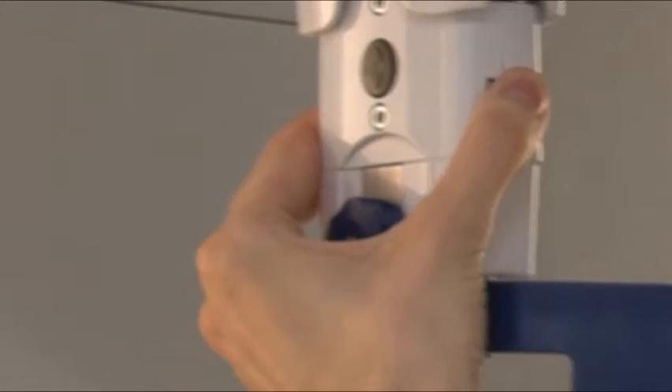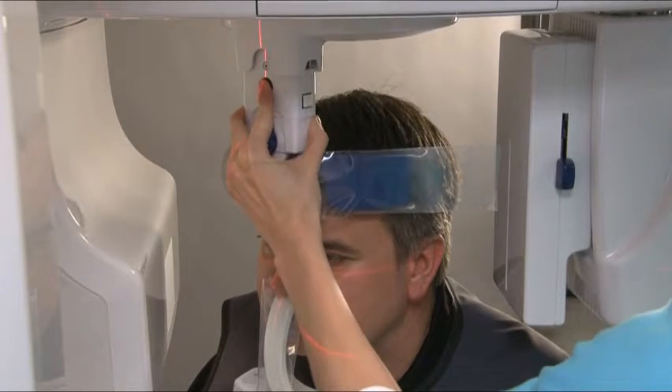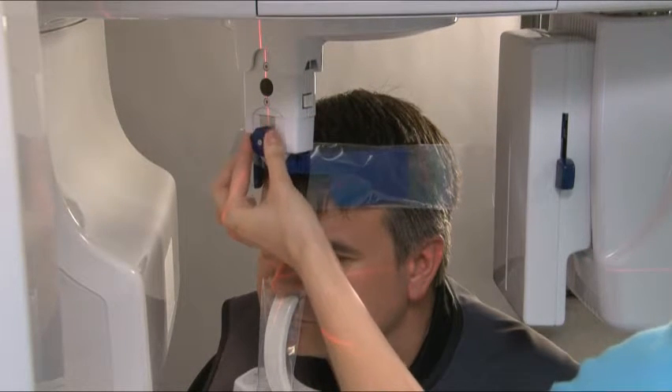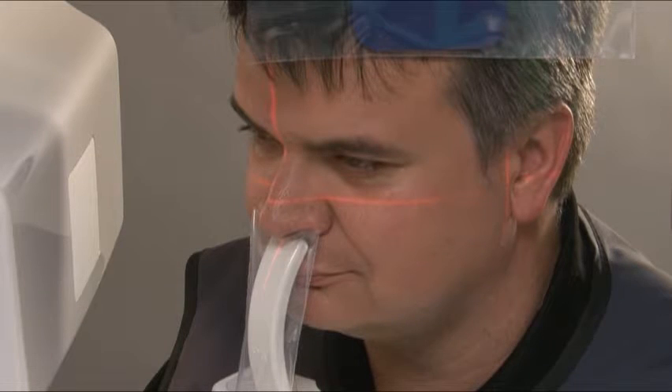Carefully push the head support towards the patient. Rotate the head support knob clockwise to close the temple supports so that they gently but firmly grip the patient's head. Check that the patient has not moved and is still in the correct position.